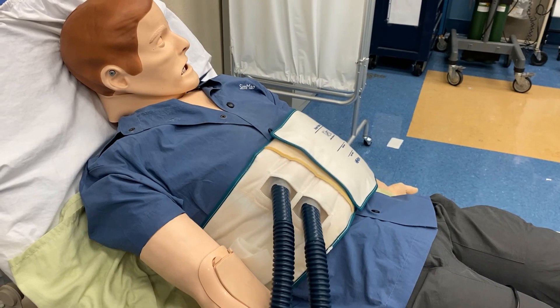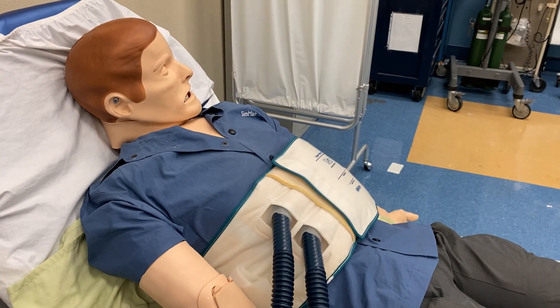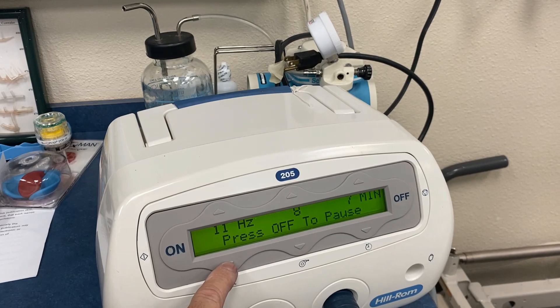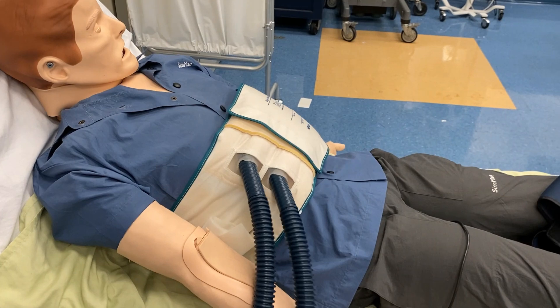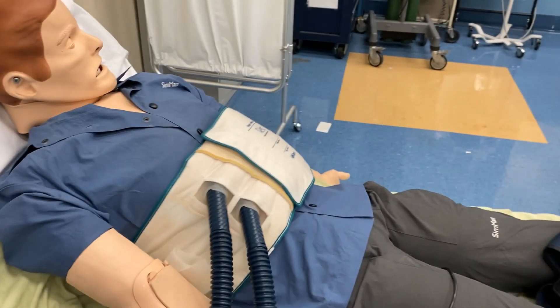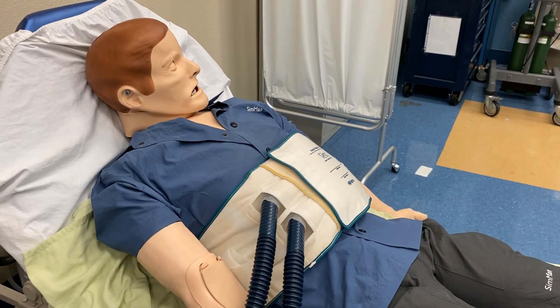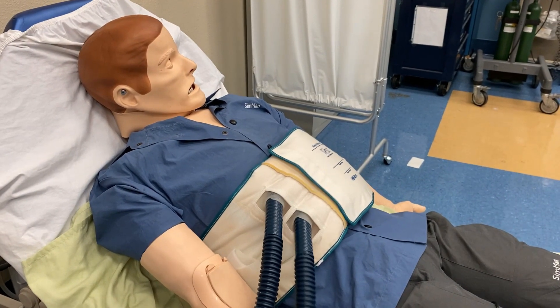The idea is to move secretions, so after the therapy is done and the equipment is removed, you really want the patient to cough. Encourage them to cough even during the therapy. We'll go ahead and slow down the frequency a little bit — you can hear that and see it visually on the patient: how 10 hertz is looking and vibrating the patient's chest. Very effective, and a mainstay in cystic fibrosis patients. Use the disposable vest and label it with the patient's name so it doesn't get misplaced throughout the hospital stay.